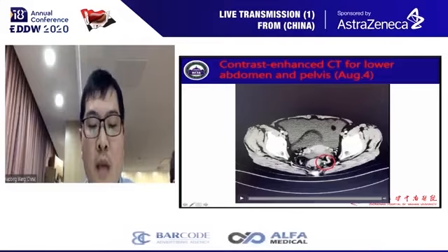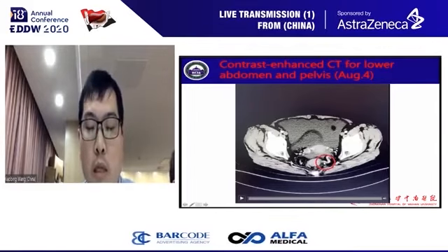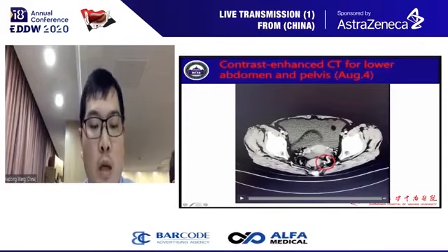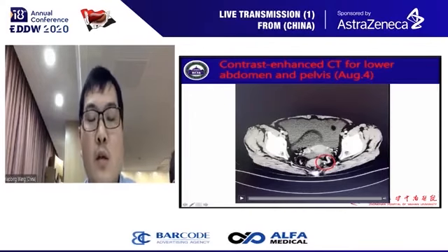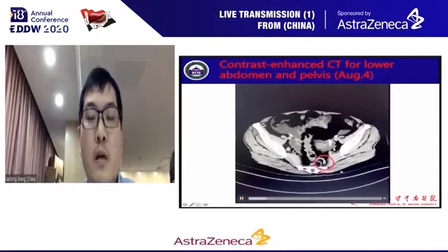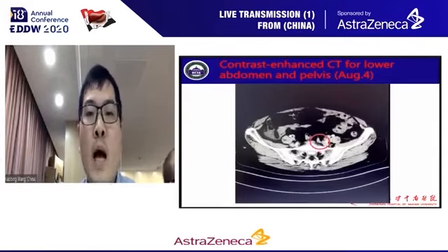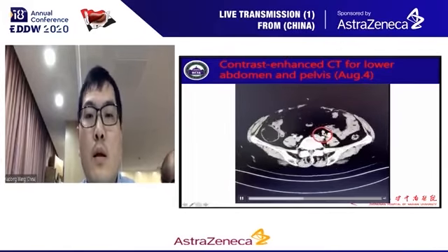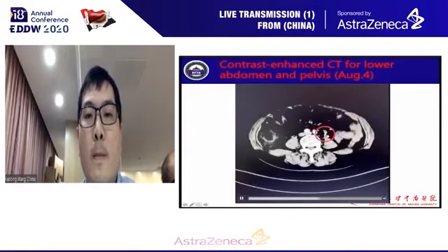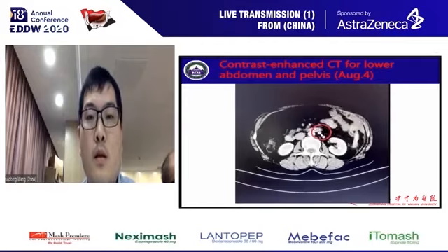In the picture, the red circle and white arrow indicated an abnormal varicose vein in the anorectal wall. And in the video, tracking from distal to proximal, up and up.